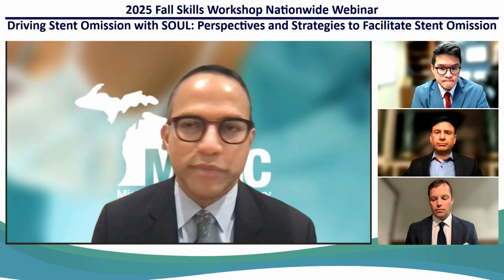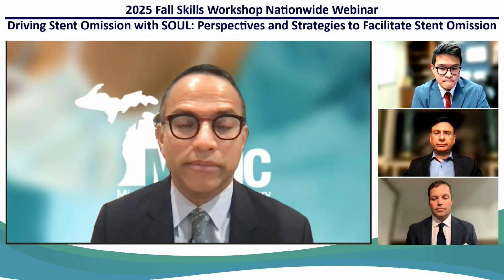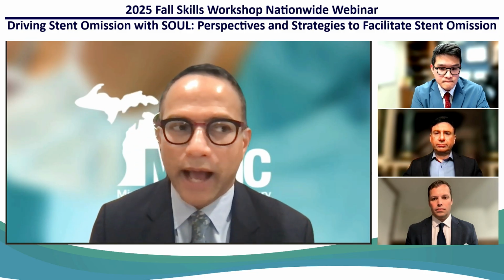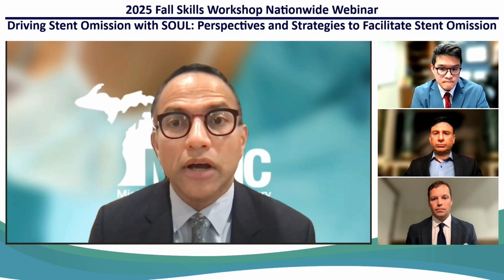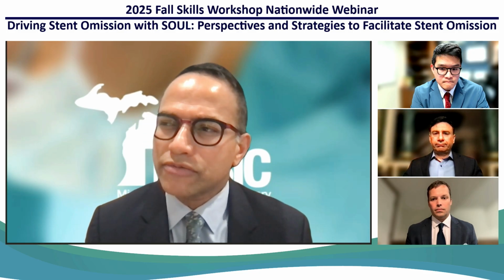Opened my eyes, and there have been multiple RCTs on this. So every patient in my ureteroscopy protocol is on an alpha blocker. And since I've done that, I can get a ureteroscope up. I'm not using a large caliber ureteroscope like a 9.4 French, but definitely the 8 French size and sometimes under. So it's really rare.